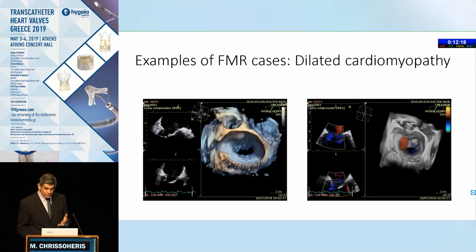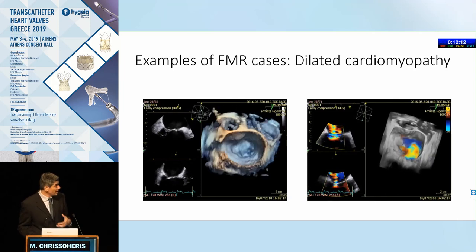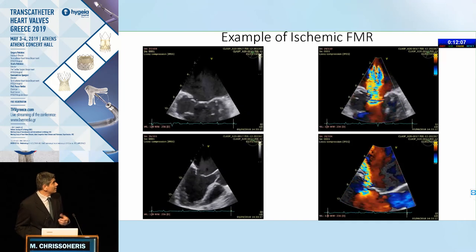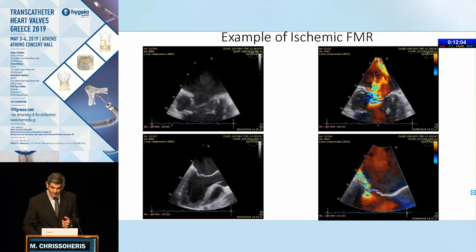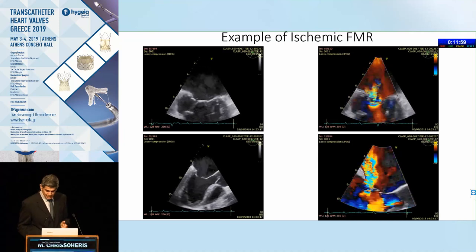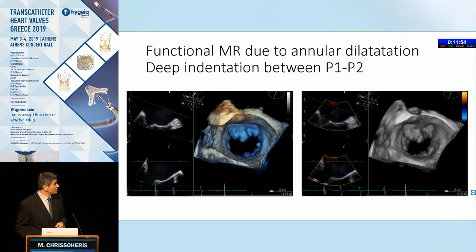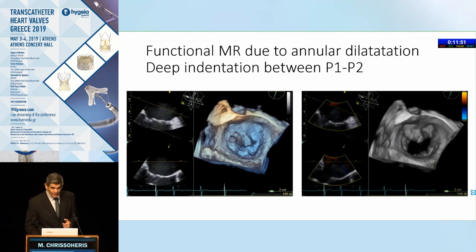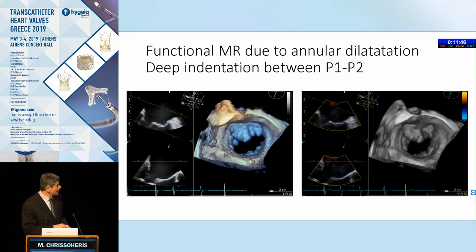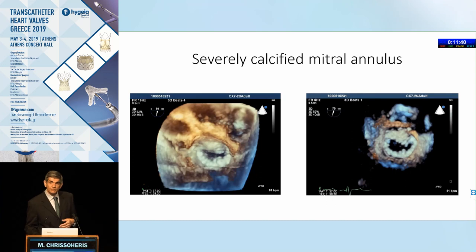The same applies to patients with dilated cardiomyopathy or ischemic cardiomyopathy. We can get multiple information from 3D echocardiography as to the location of the jet of MR. In this patient with ischemic MR, we can ascertain whether there's asymmetric tethering of the leaflets with a typical posterior jet direction. We can also see whether there are any indentations or clefts — for instance, a deep indentation between P1 and P2 on the posterior leaflet — a very relevant piece of information for the surgeon.